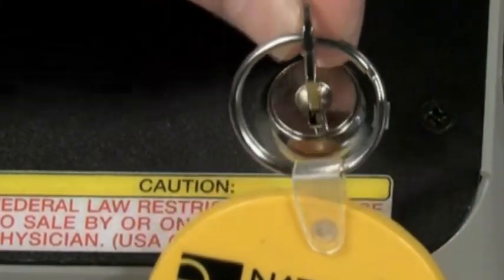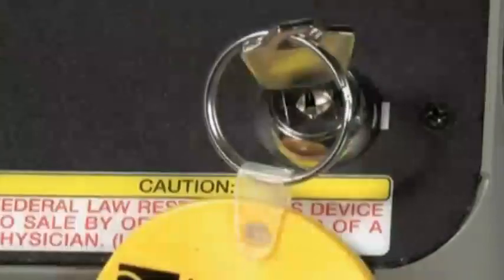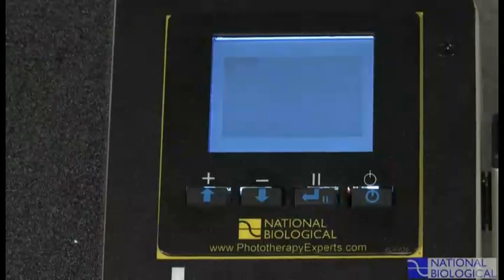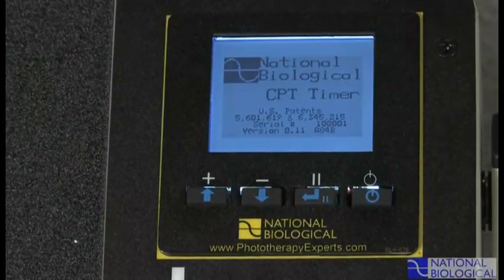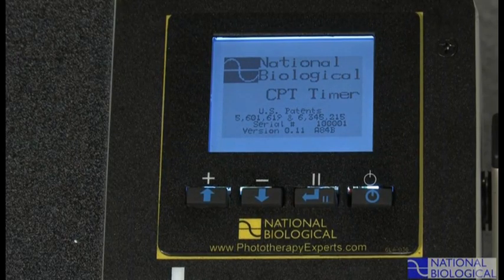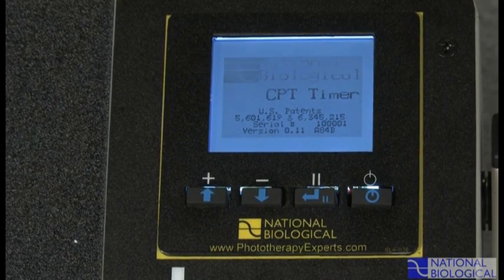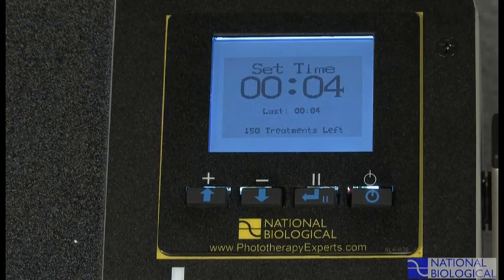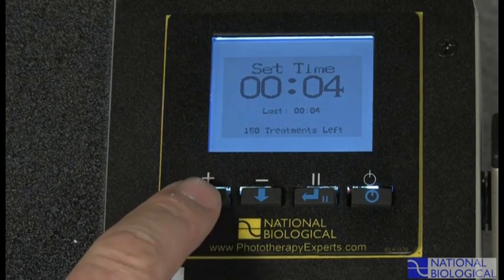To begin operation, turn the key switch clockwise to the on position. The screen will momentarily display the National Biological CPT Timer intro screen. Next, the set time screen will appear, displaying the treatment time most recently used.